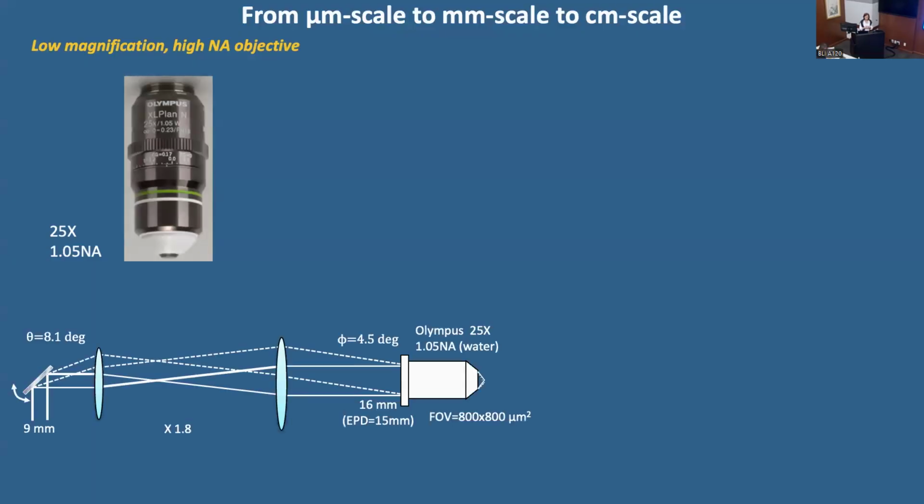Then there are some details related to the beam size that's dictated by the size of the back aperture of the objective, and then you work things backwards. You have a set of lenses that expands the beam, and you want to keep your magnification to the minimum to be able to compensate for these aberrations. So we needed to work with relatively large beams, but then we also have some limitations from the optics themselves.